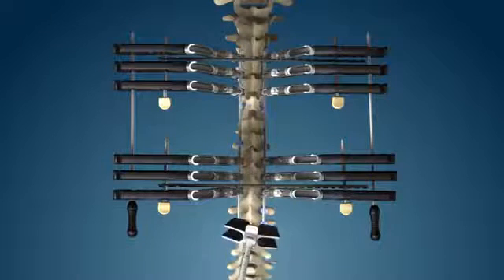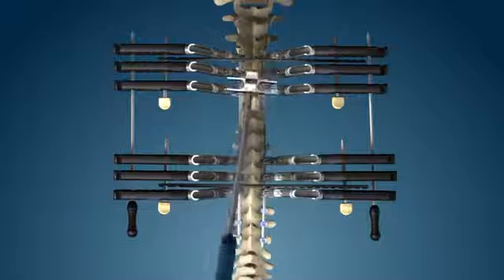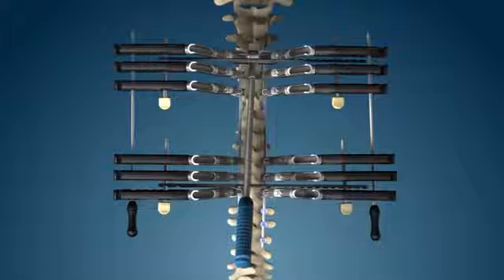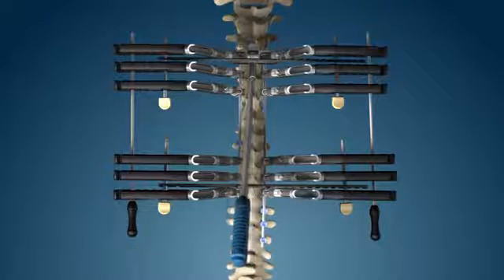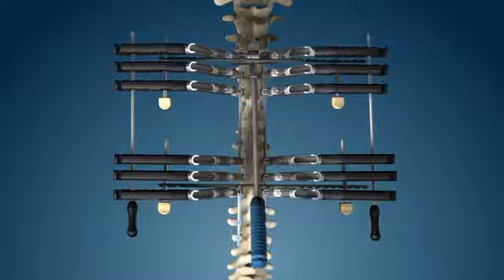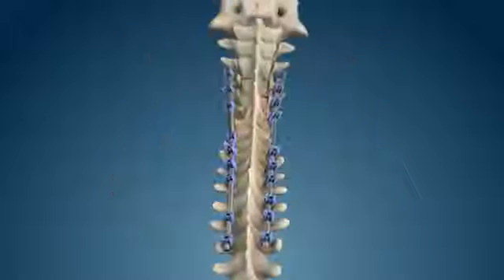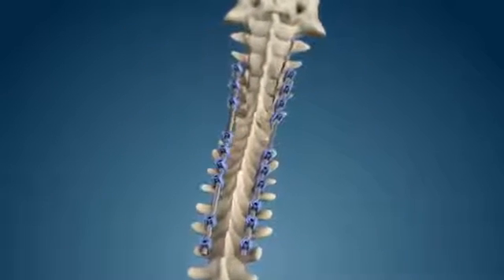A vertebral horizontalizer instrument can be used to level non-level vertebrae, providing simultaneous single-level compression and distraction with no net spinal cord elongation. All of the instruments are removed.